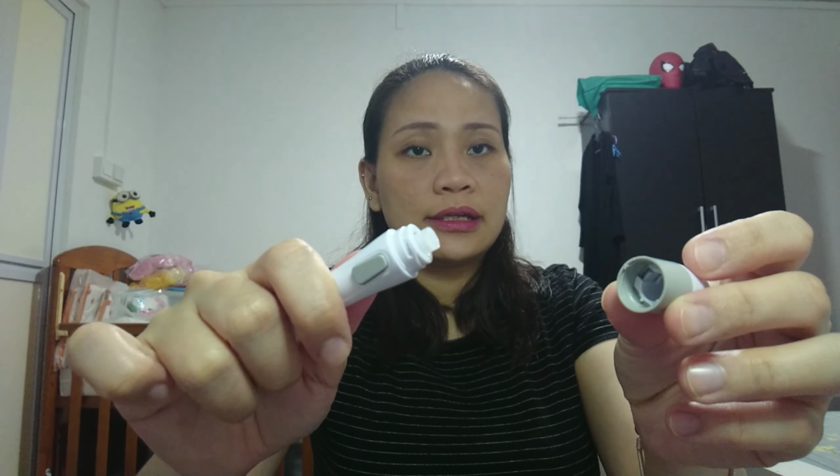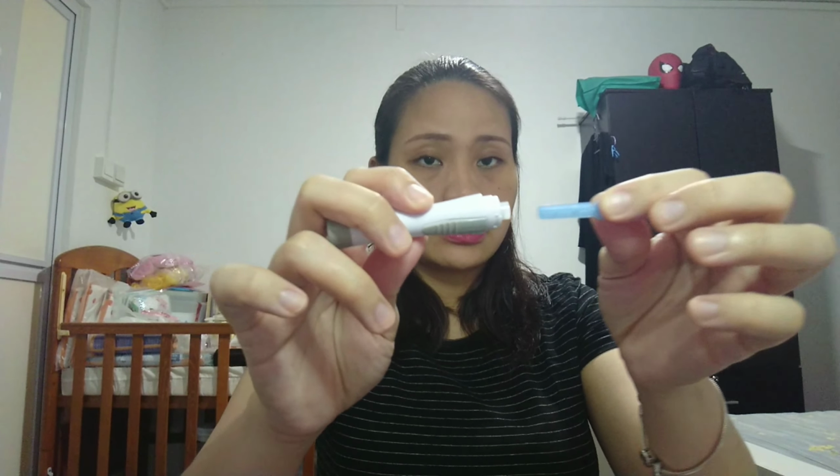Okay, as for the instruction, unscrew. So this is how you open the lancing device cover. You just need to twist it. And then after you take out this lid, you need to take one of the pins. It shows to put it this way. Insert the sinocare lancet into the sinocare lancing device until it comes to a full stop. So you just need to put it all the way inside.